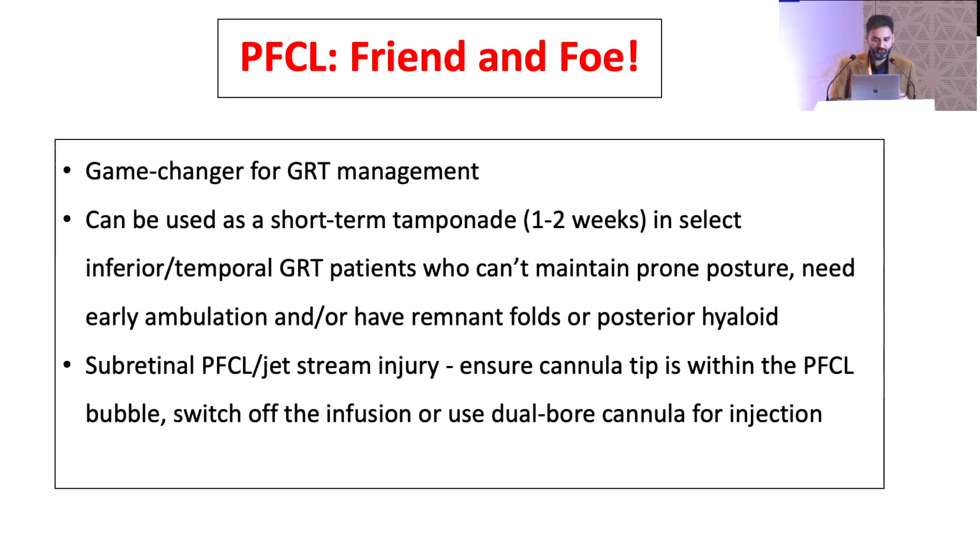And I'm going to finish with this one slide and not show the other two cases for want of time. PFCL, big friend, we don't have to lie on our back, and the patient doesn't have to be suspended up in the air and us do all these gymnastics to try and fix giant retinal tears. Now, heavy liquids, big boon, completely revolutionized giant retinal tear detachment surgery.